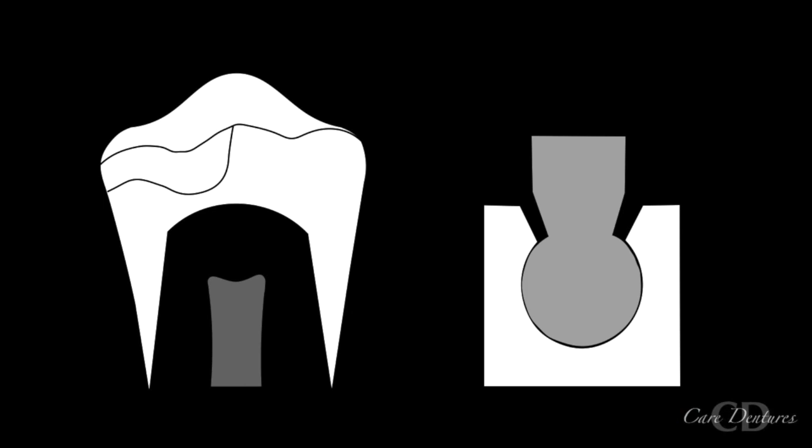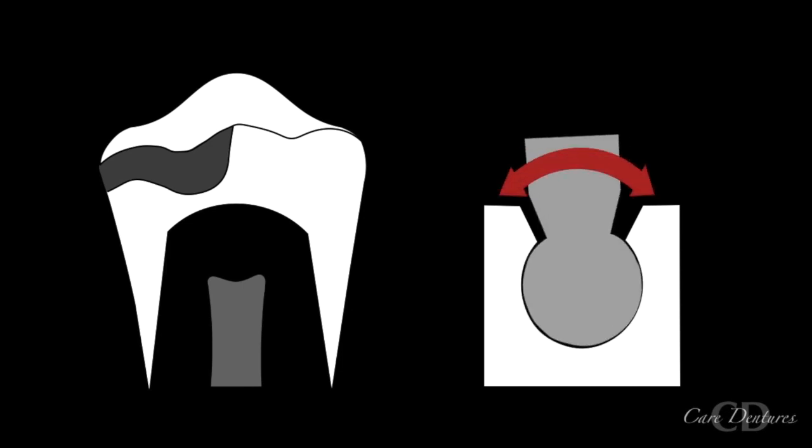Let's begin with an important consideration. In a proximo-occlusal rest on a posterior tooth, it is imperative to create a seat that is shallow and its base absolutely well-rounded, like the shape of a spoon. This would make the rest and rest seat akin to a ball and socket configuration. This geometry permits dissipation of potentially harmful lateral forces on the abutment tooth.